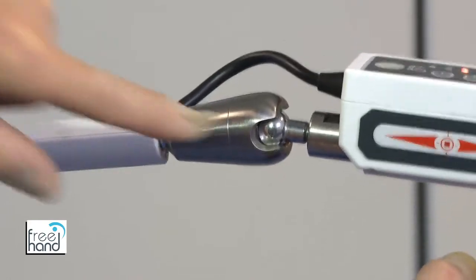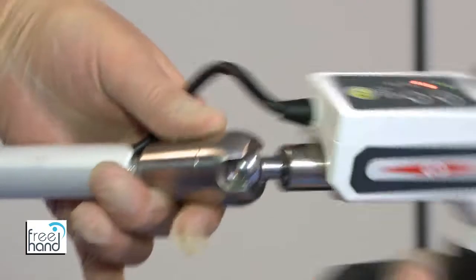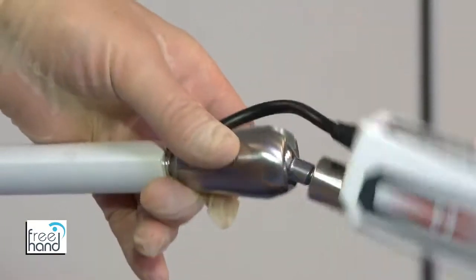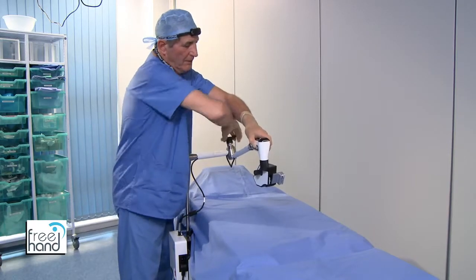This is just to repeat the point that the wrist joint has got two notches to allow motion left and right, and also to go up and down. But it's important to understand where the notches are, and then lock off.